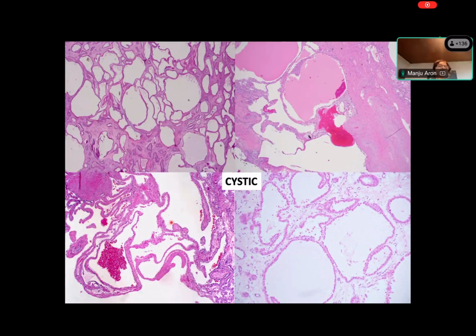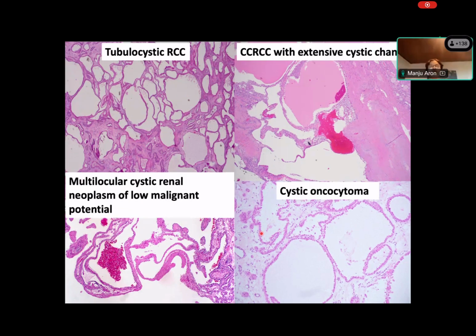Again, these are examples of cystic tumors. This is one where you have multiple size cysts here on your left upper panel. I don't know where this has gone now. Okay, can you see my pointer, the laser pointer? Okay, so here you have multiple cysts, but you have this kind of hyalinized stroma, no solid areas, and cysts, but you have some solid areas here. Another example of just cysts without any solid areas, cysts lined by pink. So these are all tumors with a cystic architecture, but these are all different kinds of tumors. So it's important to know what the differential diagnoses are.